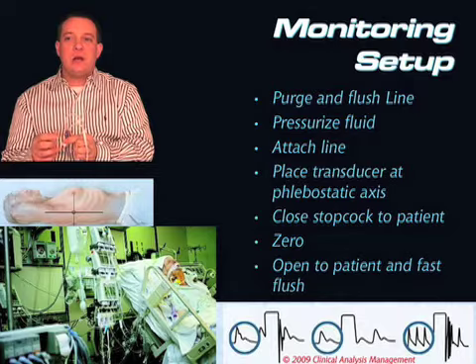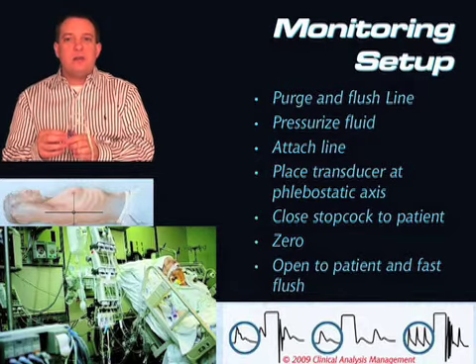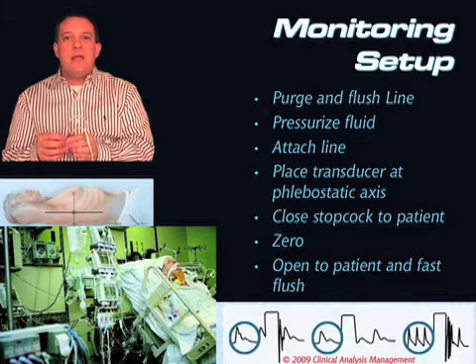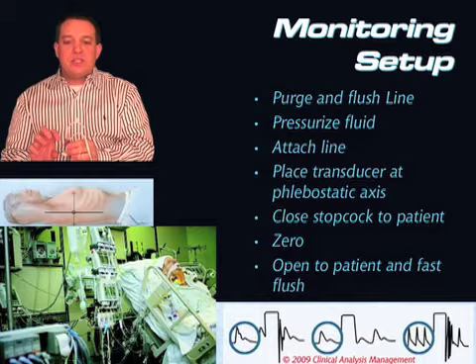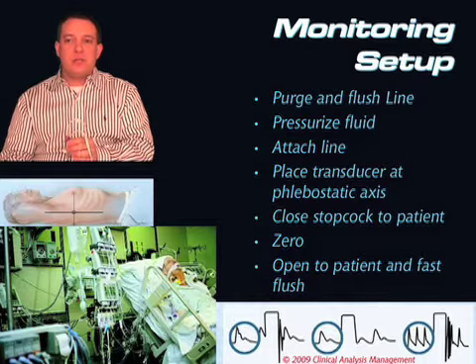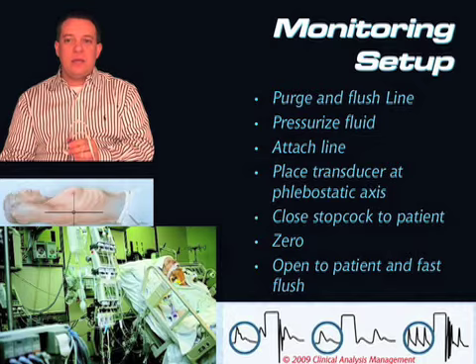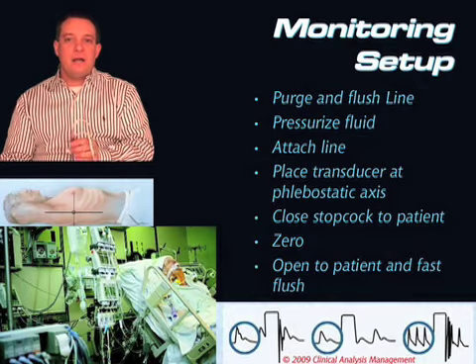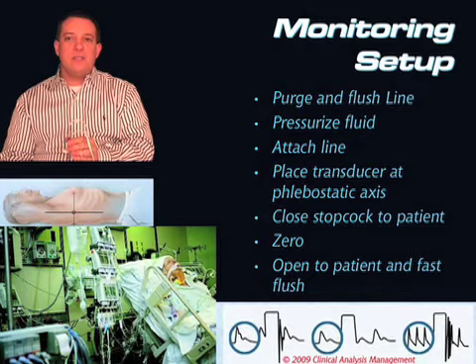What we're measuring here is whether there's something called damping. Damping is how sensitive the system is to changes in pressure. We can have normal damping, we can have excessive levels of damping, or we can have inadequate levels of damping. We call excessive damping overdamping, and if there's not enough damping, we call that underdamping.